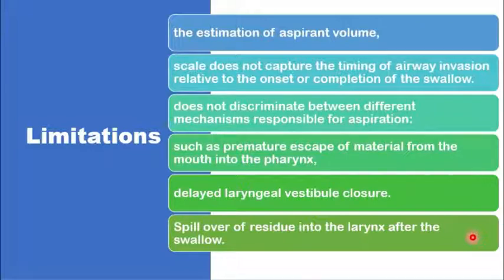Despite limitations, the video fluoroscopy estimation by the penetration aspiration scale remains the gold standard.